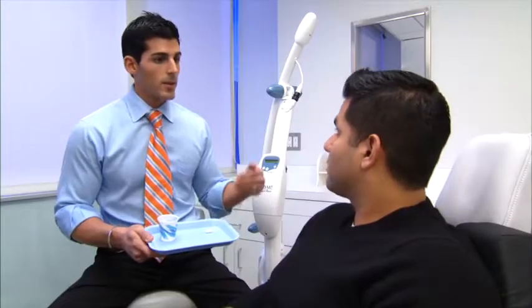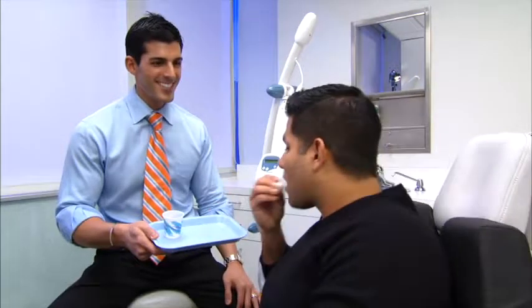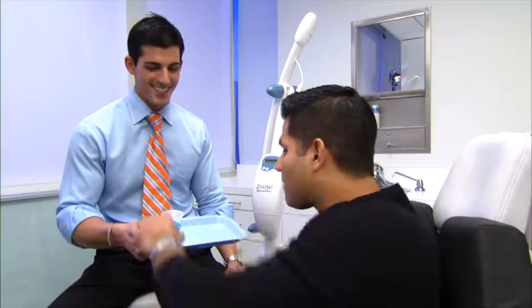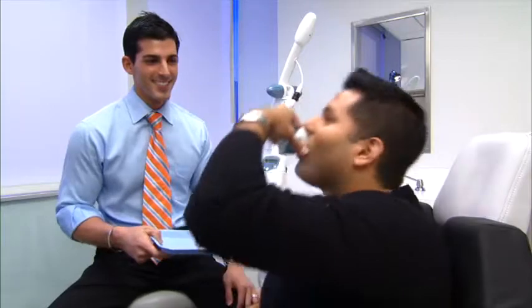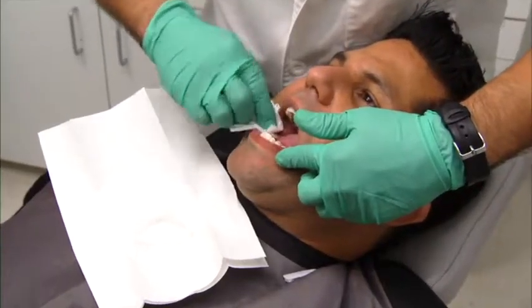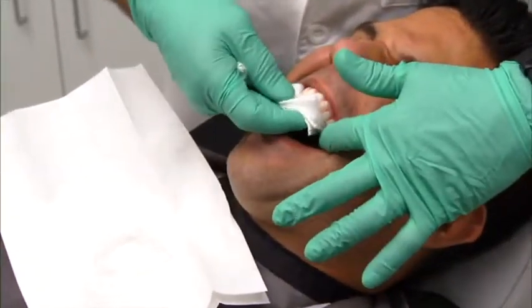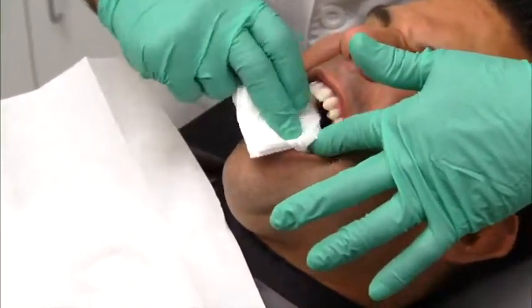As with most whitening procedures, patients should be informed to expect mild to moderate short-term teeth sensitivity. A mild overall ache is normal and will go away in 24 to 48 hours. Some patients may experience occasional sharp pains during the procedure. These are also normal and will go away in 12 hours.